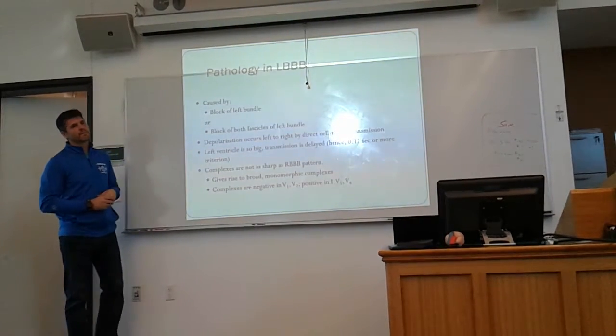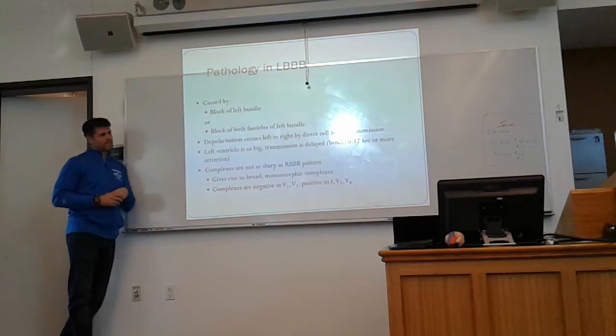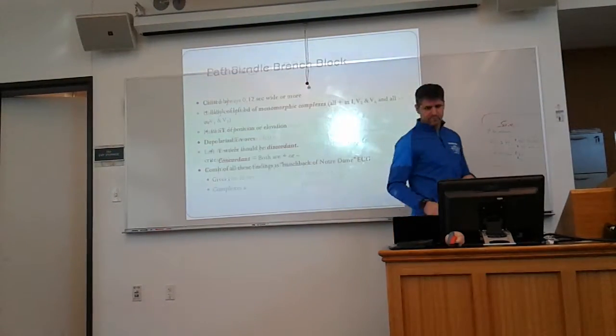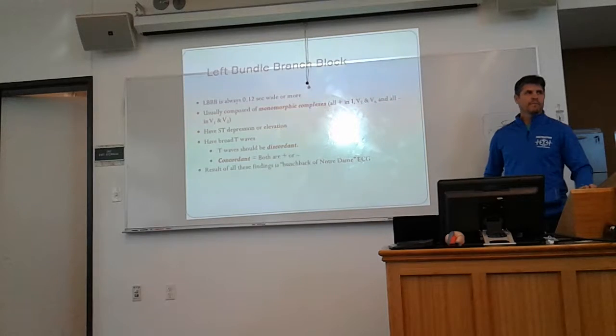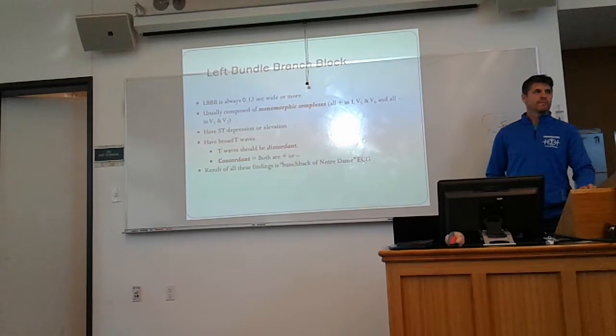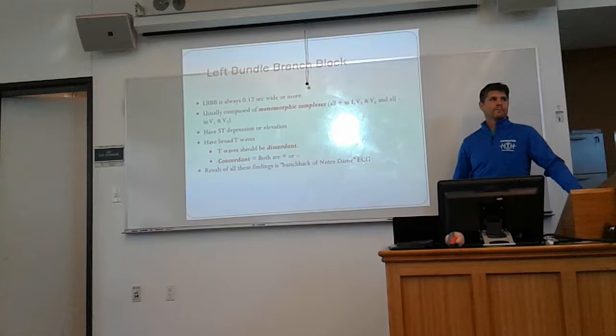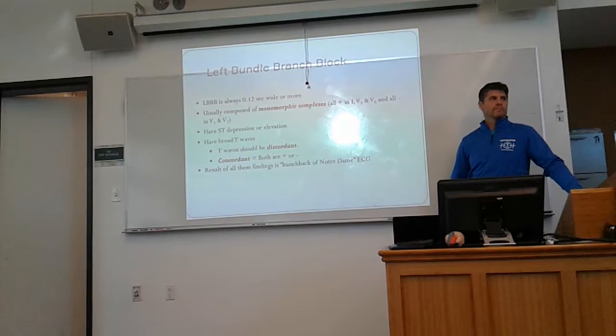So, Cory, maybe I'm going back a slide, but practically speaking, if I put a patient on the monitor and I see ST elevation between 2 and so I run a 12 lead, then I'm trying to exclude a left bundle branch block by saying, okay, well now my QRS is wide, my T waves are discordant, so I can't call a STEMI. You cannot call a STEMI with a left bundle branch block.